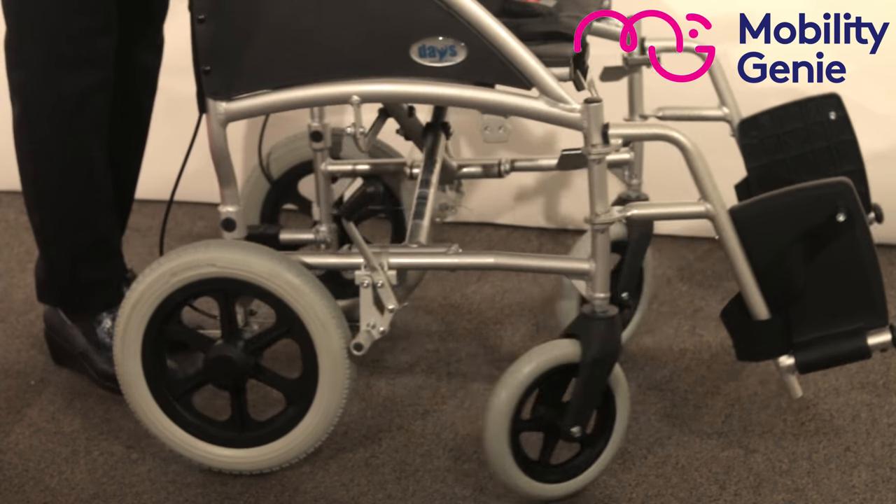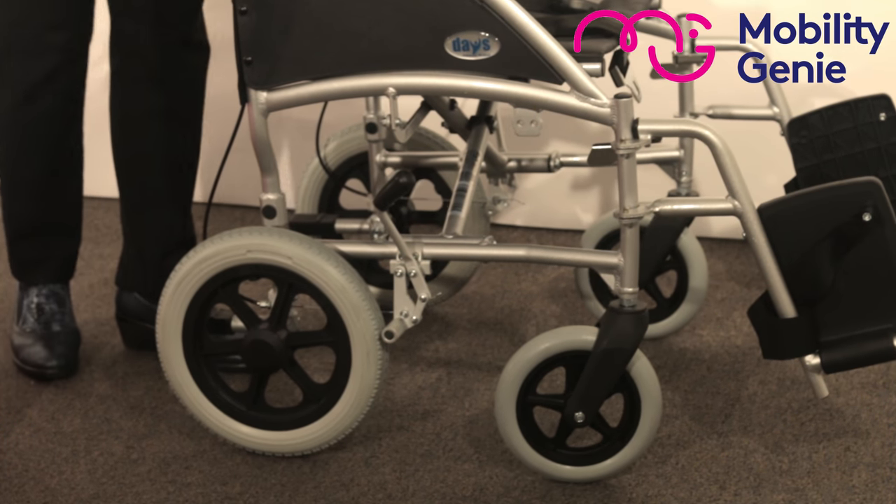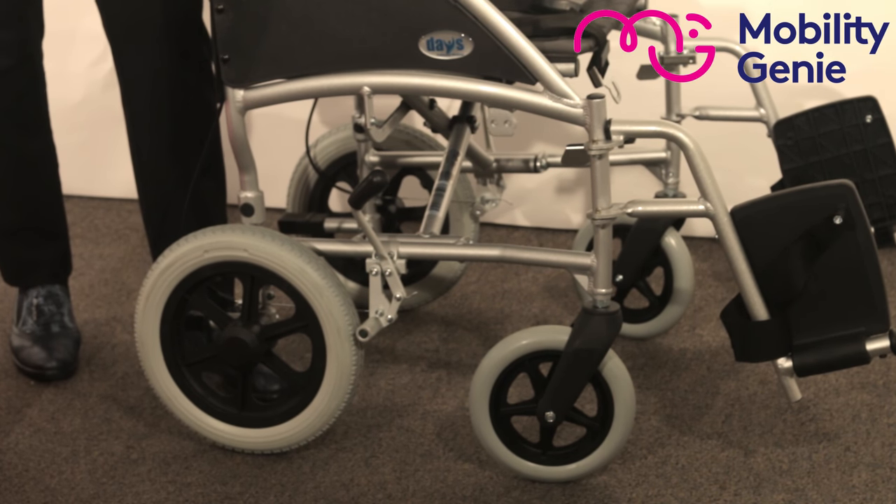The front wheels are swivel and the back wheels are solid, so you don't have to pump them, which makes them easy to maintain.